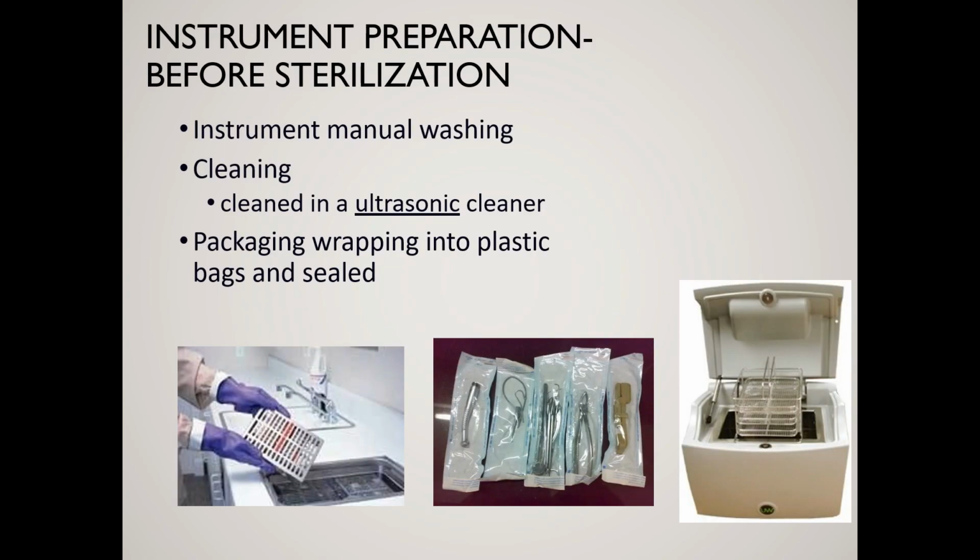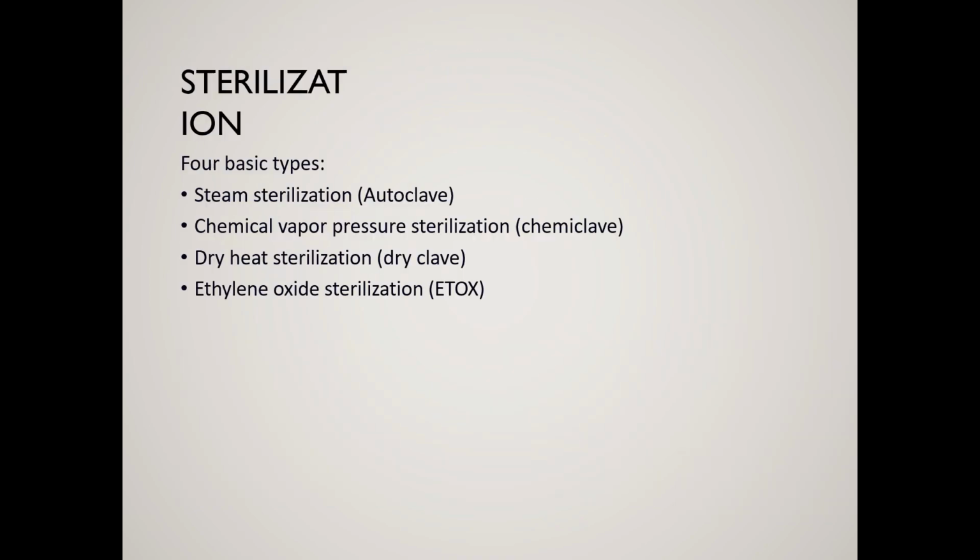Moving on to the next slide, instrument preparation before sterilization. How do we prepare instruments before sterilization? We have to manually wash the instrument and clean it in an ultrasonic cleaner, wrap it in plastic bags and seal it, and then send it for sterilization.